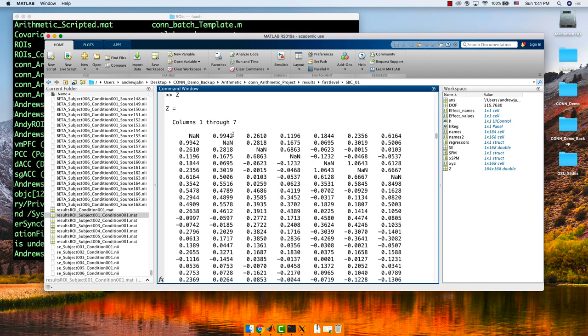You can input those into R, do a group factor, do whatever you want. It's a similar way to do what we're doing in the CONN GUI.